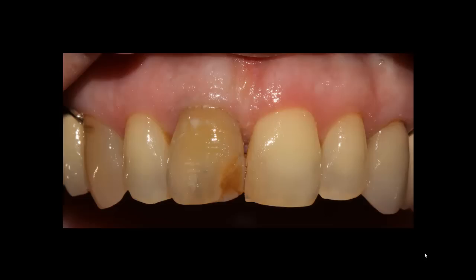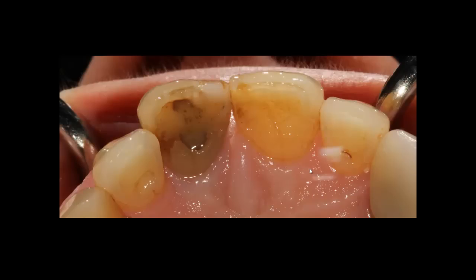Let me explain why I chose Real Life. If I look at number nine and number ten, I can see the halo of the dentin body. The most suitable material here is Real Life so I can adjust the halo of the dentin. Looking at the lingual side of number eight — we tried to preserve it but it's already been destroyed, there's a lot of decay underneath, old composite to remove, and the stump shade is going to be very dark. I'll make sure the crown blocks the darkness of the stump shade.